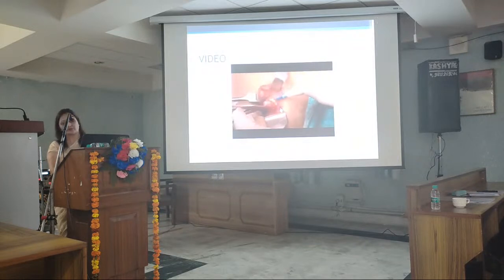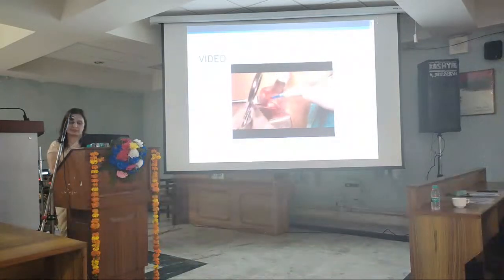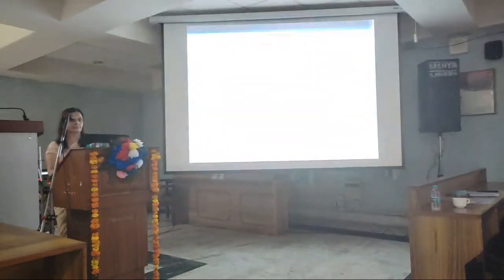So as we are running short of time, I will proceed to my slides. After doing all this exercise, in brief, we are putting our probe on the primary tumor, and we are again counting, putting the probe on the axilla, and where we get the maximum count, we put a small incision, and we are having 4 possibilities.